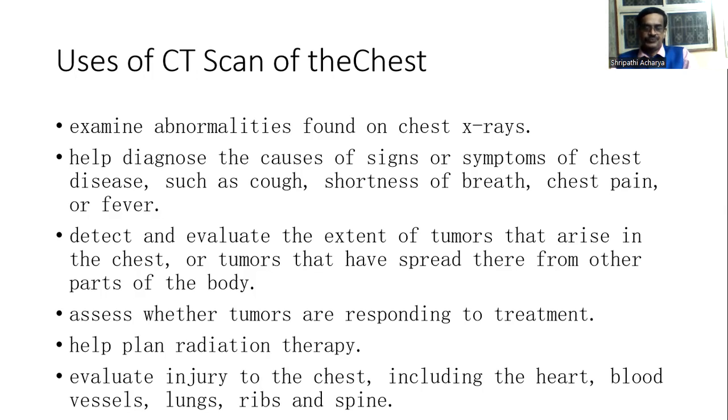To help plan radiation therapy and to evaluate injury of the chest, including heart, blood vessels, lungs, ribs, or spine. Suppose there is history of trauma, you can assess the extent of injury to the organs.